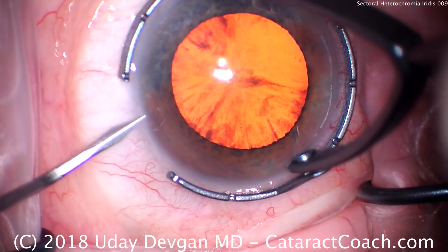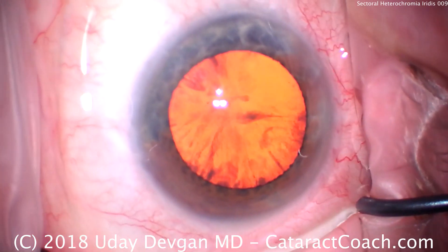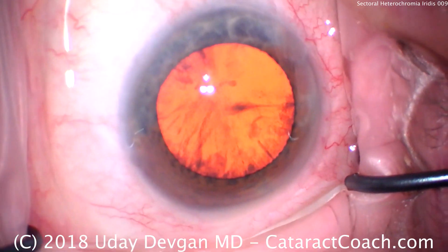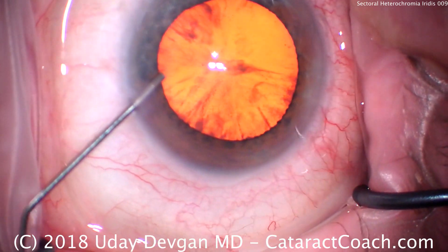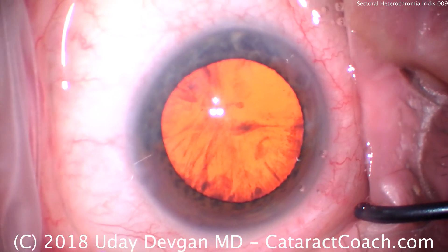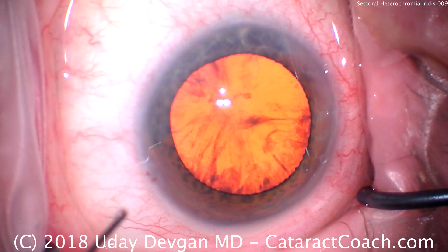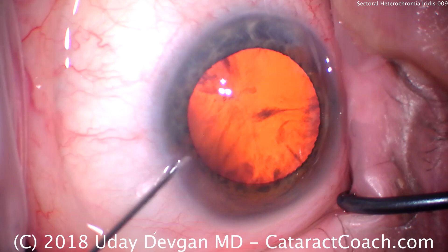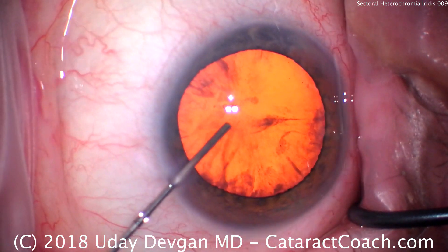This is Dr. Devgan, your cataract coach, with a relatively routine case. What's interesting here is the patient has heterochromia — a sectoral heterochromia. The temporal half of the iris is brown and pigmented, whereas the nasal half of the iris is blue and lacking pigmentation. The patient doesn't have any other issues going on with the eye other than a routine cataract.